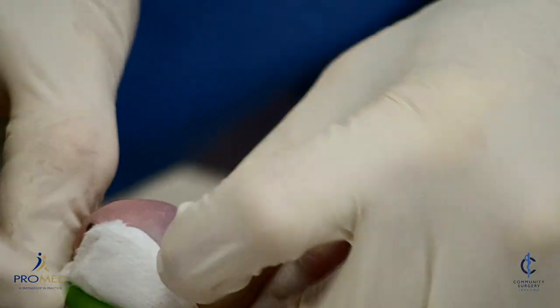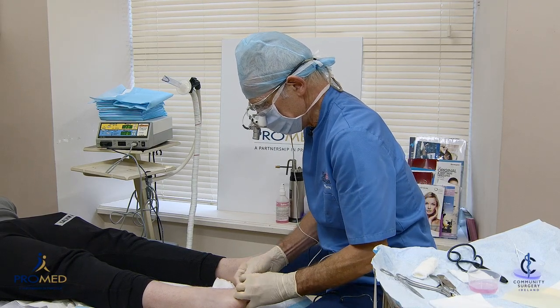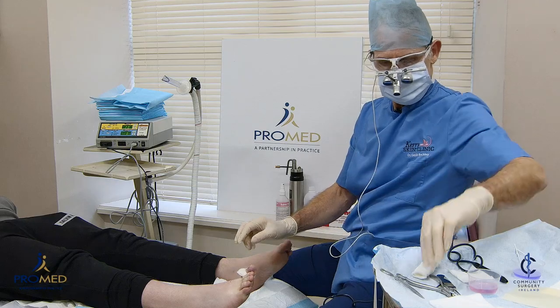You have to be very careful with this procedure. If patients are on anticoagulants, we try to stop them if possible — though that's not always possible. You can see the toe has gone a little bit white. Now we're ready to split the nail.